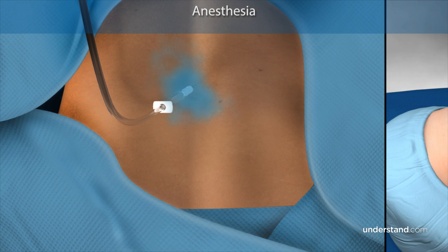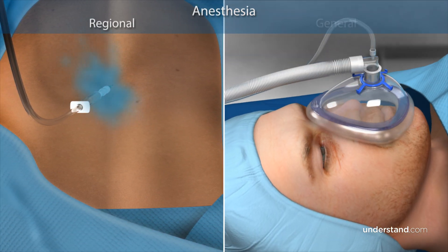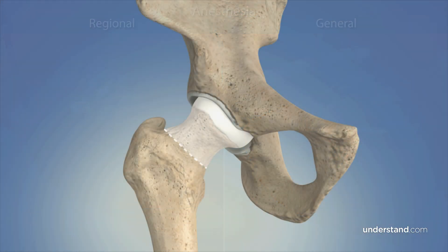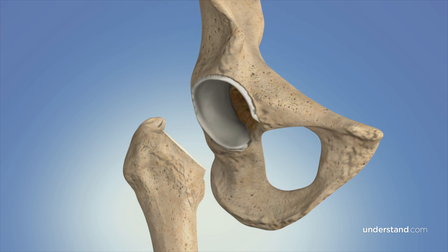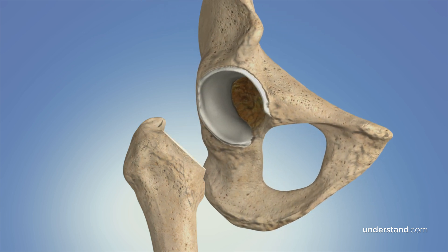Your anesthesiologist will determine whether to use regional or general anesthesia. First, the head and neck of the femur are removed in order to provide access to the acetabulum. Next, the damaged cartilage of the acetabulum is removed and a metal socket is attached via screws or cement. A spacer, made of plastic, ceramic, or metal, is inserted between the prosthetic ball and socket to allow for smooth gliding motion.